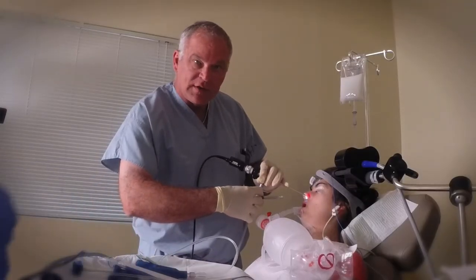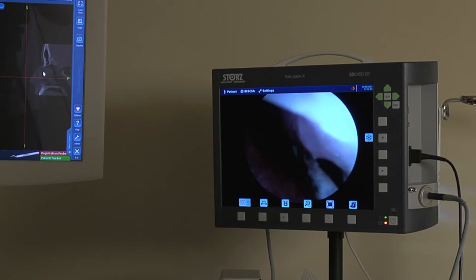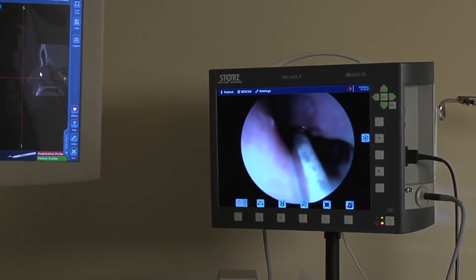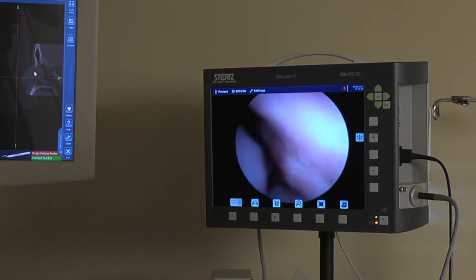All right, we're going to start off here doing a little balloon sinuplasty. The first thing we're going to do is inject the turbinates with a little bit of numbing solution. We're going to later on come back and ablate these things.